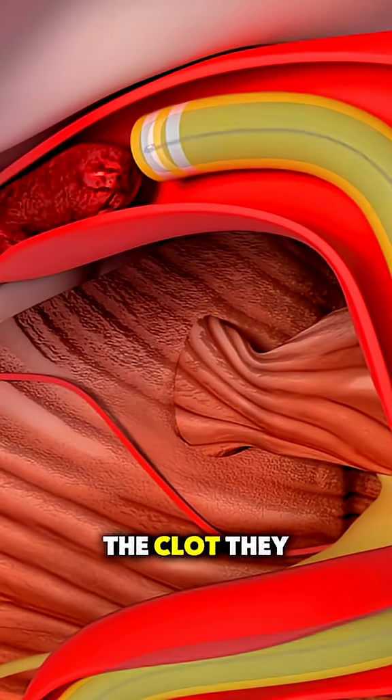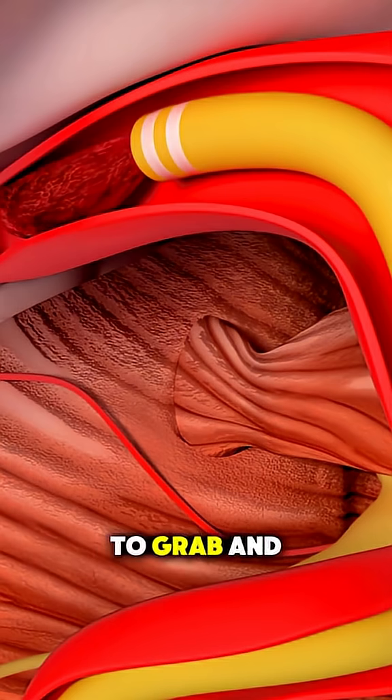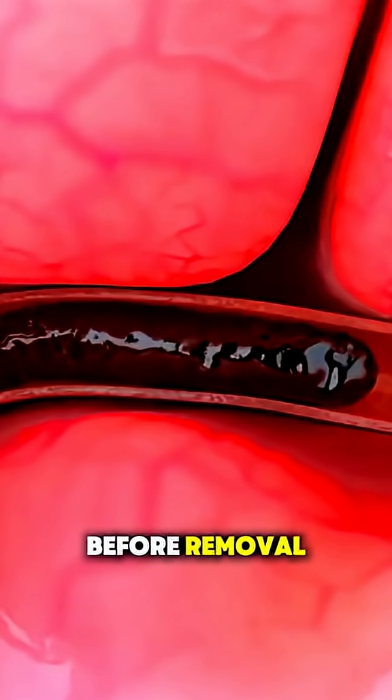Once they reach the clot, they can use a special device, like a tiny mechanical retriever or suction tool, to grab and pull the clot out. In some cases, they inject medication directly into the clot to dissolve it before removal.